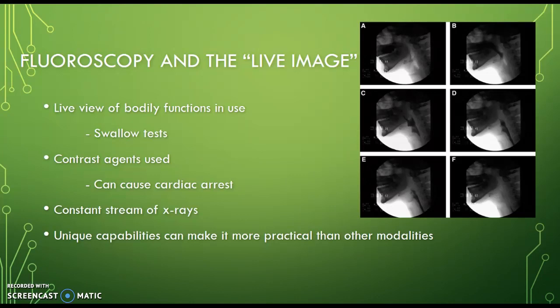Like I said, contrast agents are used pretty frequently, and they are used to clearly define bodily structures. However, the use of contrast agents can cause cardiac arrest in some patients. So the medical team that is in the room and part of the procedure should be aware of this, and if anything were to happen, they would need to respond very rapidly.